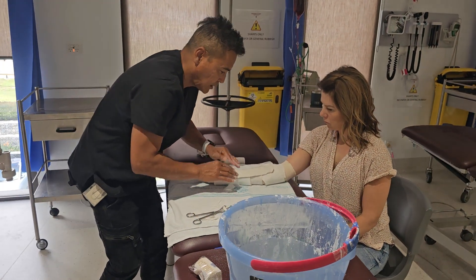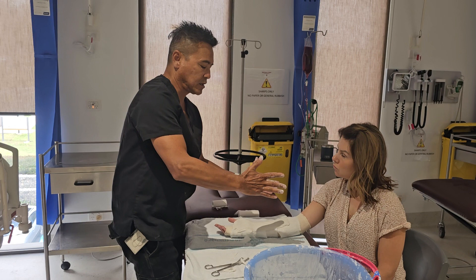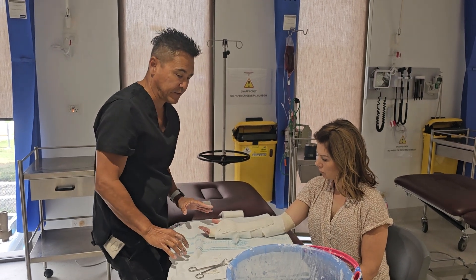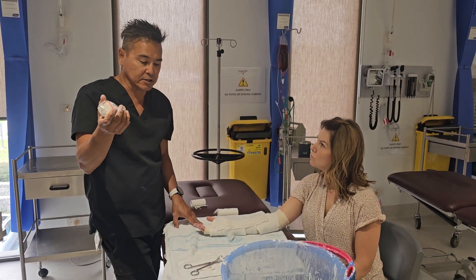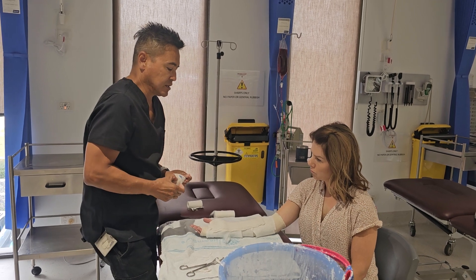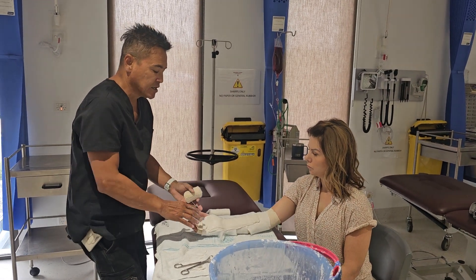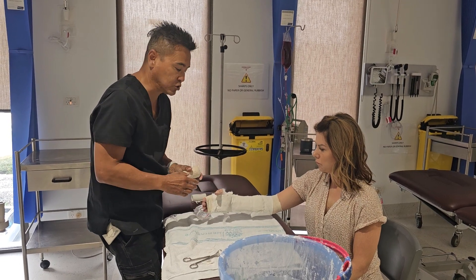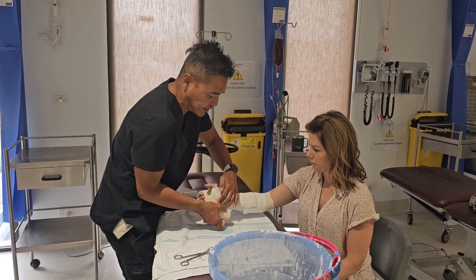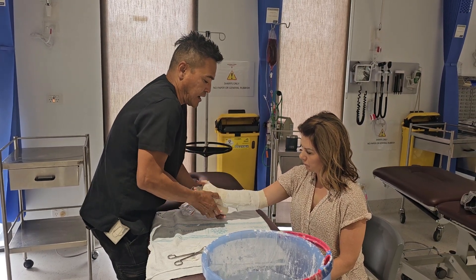I place the plaster slab and check that I'm happy with where the marked line is underneath. I don't mind leaving a little bit of water on the plaster because it helps it mold in with the cotton and become one unit. Then I apply a simple crepe bandage. I get Rachel to shape her hand as though she's holding a cup — that's a neutral position — and that's how her hand should be.